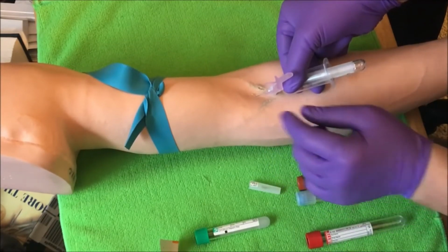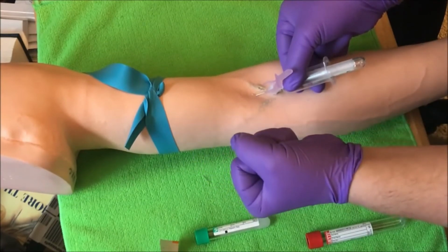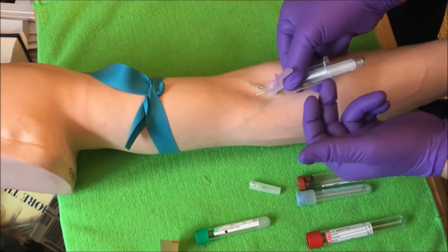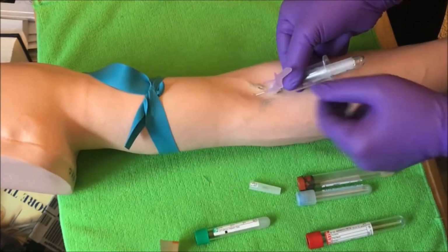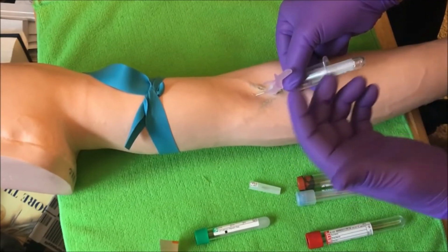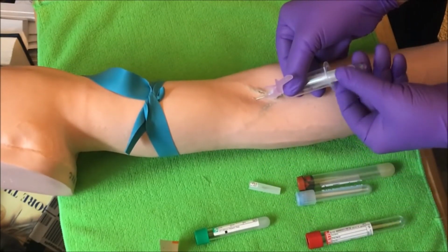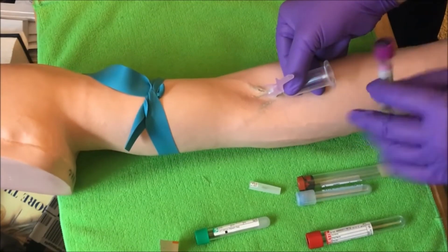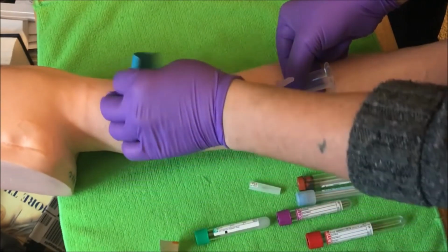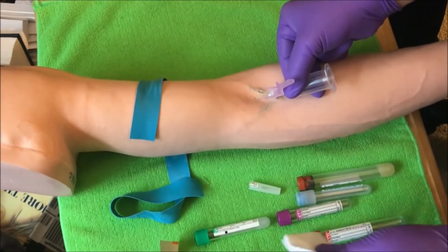But if I'm in and this is actually doing its job and helping, squeezing the vein a little bit to help restriction, to push the tube with the vacuum in it and getting the blood in, me releasing it before it fills up could cause the blood to stop, and then I have to restick the patient, which I never want to do. So what I want to do is first pull my tube out, invert, put it down, release my tourniquet the way I showed you, pull towards you, and then get my 2x2 gauze right here.